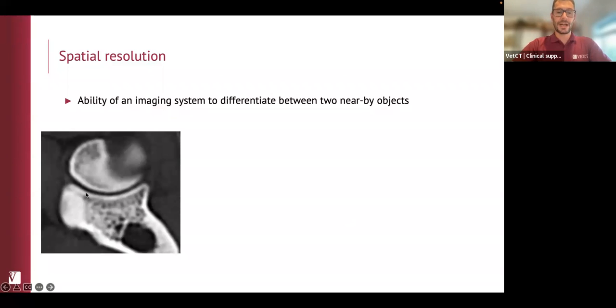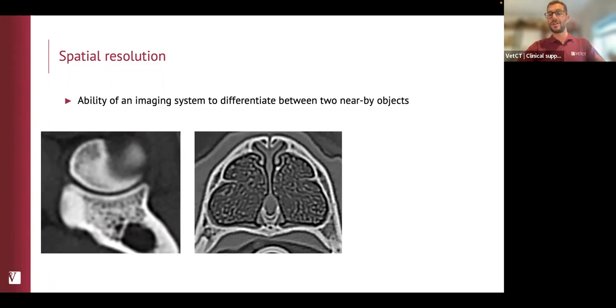And if we look, for example, at an elbow, you can see things that are extremely small. For example, you can see this hyperattenuating, so white band here, which is subchondral bone, which is submillimetric. You can see really nicely, for example, the joint width, which is quite constant. It's really narrow, but it has really sharply demarcated margins. We can see the trabecular bone. So excellent visualization of the small stuff.